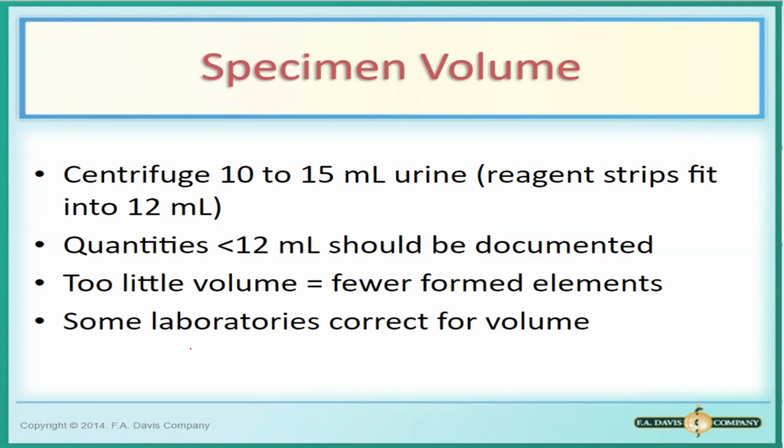Also, standard na 10 to 15 ml kasi para mas marami kang elements na makuha. Kapag mas konti yung volume ng urine, fewer ang formed elements na makikita mo.